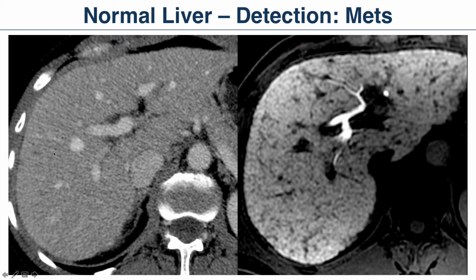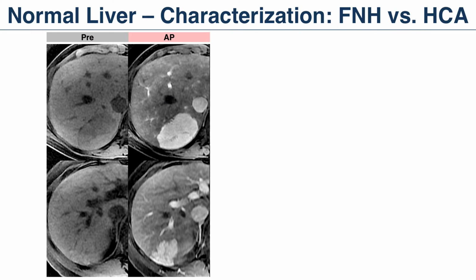But let's say we knew this patient had 5 metastases that we could see on CT, and we could follow them, then if the patient's not going to be considered for surgery, they're just being treated with chemotherapy, then is it really necessary to see all the Mets? Probably not. So use your judgment, but if it's important to see each individual metastasis, then consider Gadoxetate.